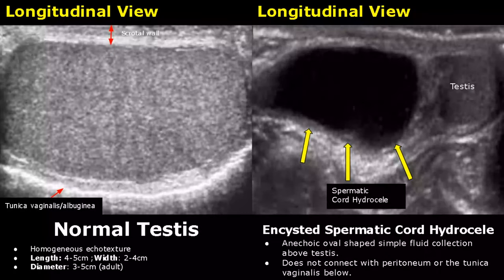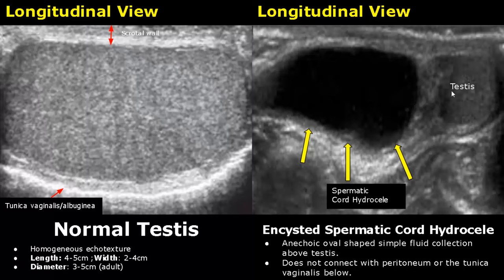An encysted spermatic cord hydrocele is a fluid collection above the testes. This fluid collection will not surround the testes and won't connect with the peritoneum above. It is usually anechoic and oval shaped.